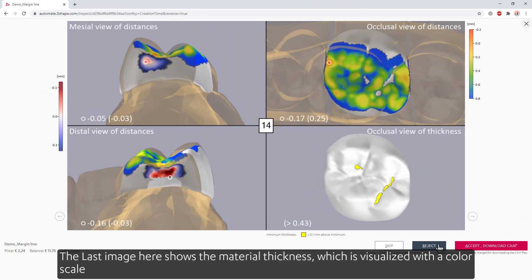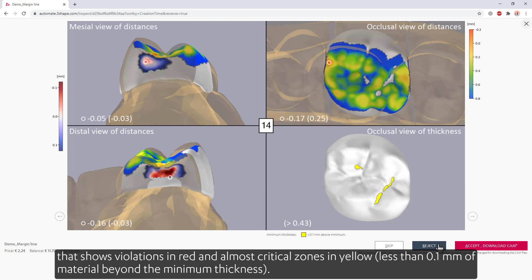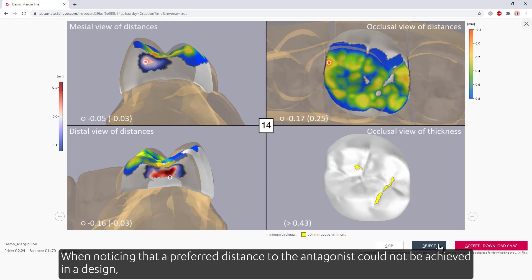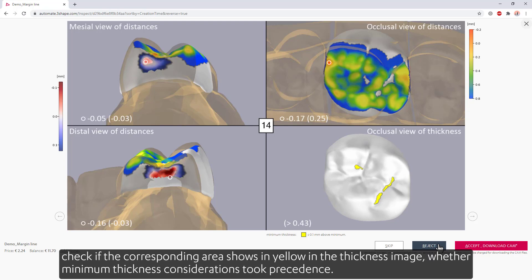The last image here shows the material thickness, visualized with a color scale that shows violations in red and almost critical zones in yellow — less than 0.1 mm of material beyond the minimum thickness. When noticing that a preferred distance to the antagonist could not be achieved in a design, check if the corresponding area shows in yellow in the thickness image, to see whether minimum thickness considerations took precedence.